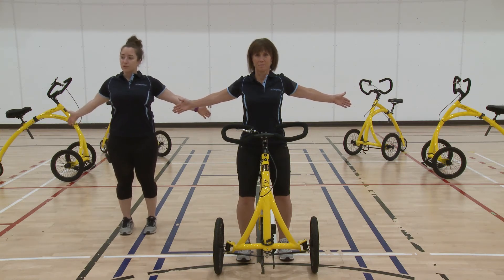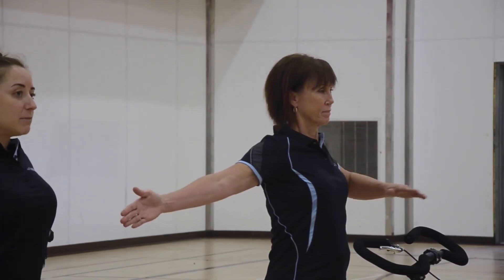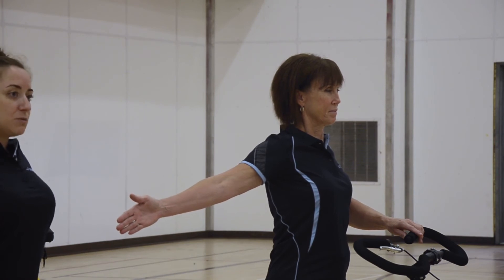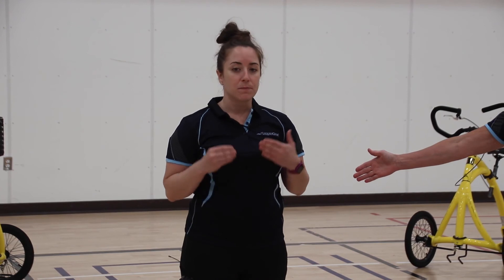You want to hold your stretch for 30 seconds. If you're uncomfortable having both arms off of the handlebars, go ahead and grab one hand onto the handlebar and just repeat with the one arm. Make sure you're holding for 30 seconds per arm, or 30 seconds total with both arms.